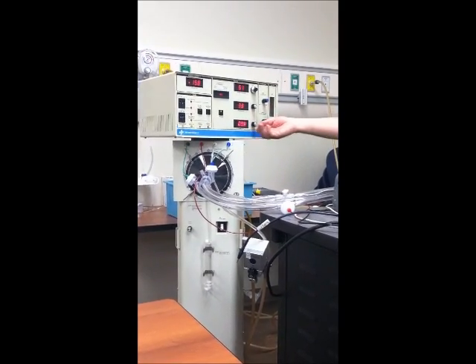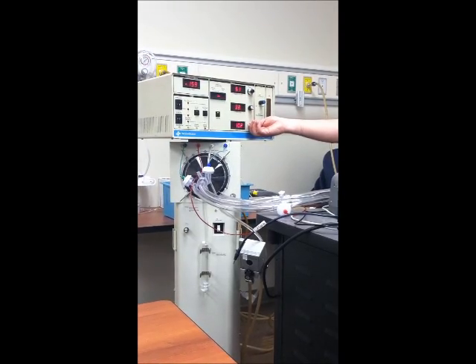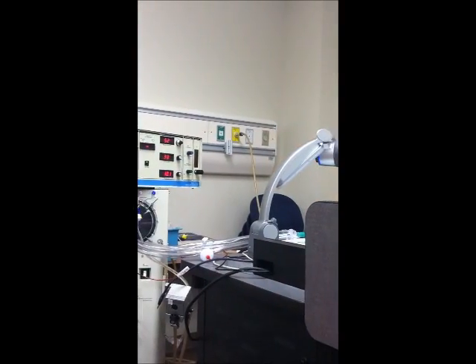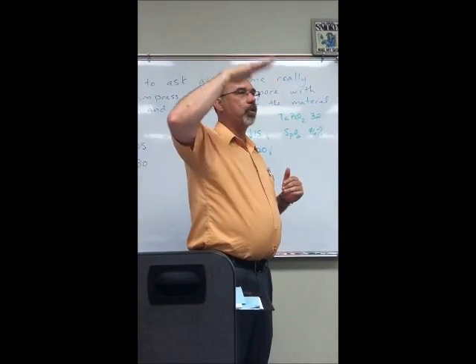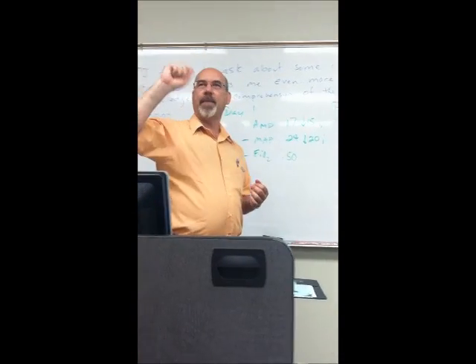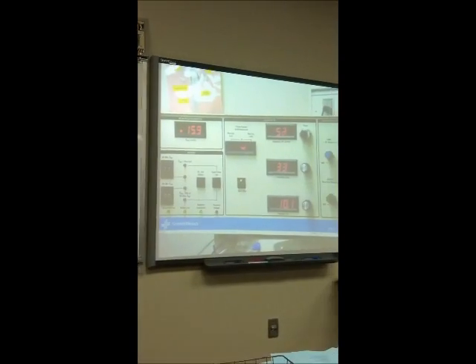Yeah, you'll drive yourself crazy. And that's part of the reason one of the hospitals uses the knobs rather than the readings, because they will change on the baby. In other words, a power of 6.0, if the baby's compliance or their lung mechanics change, the amplitude may change without even changing that power knob. So their philosophy is, rather than chasing the amplitude, you just leave the power where it is and take the amplitude that you get.